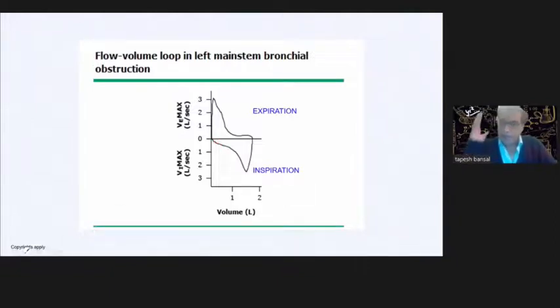Normally in airway resistance increase, you do not get an abnormal pattern in inspiration, because in the process of breathing, increased resistance in the diseases is mainly manifested in expiration, because resistance is mainly increased in expiration. Because in inspiration, everything is dilating, right? The airways are dilating, the lungs are dilating, while in expiration, the lung is collapsing, the airways are collapsing, and in COPD, there is marked spasm also.